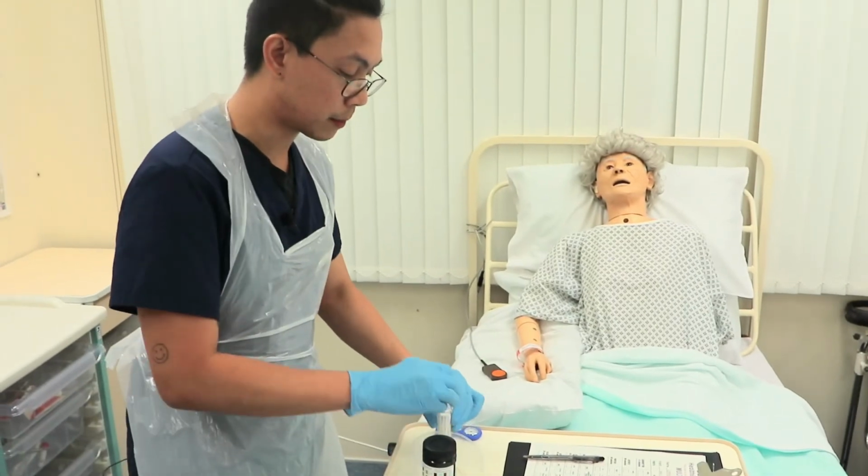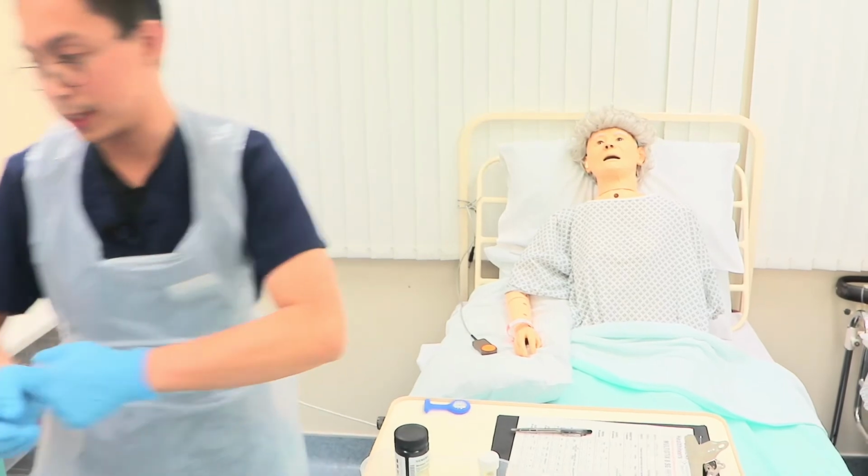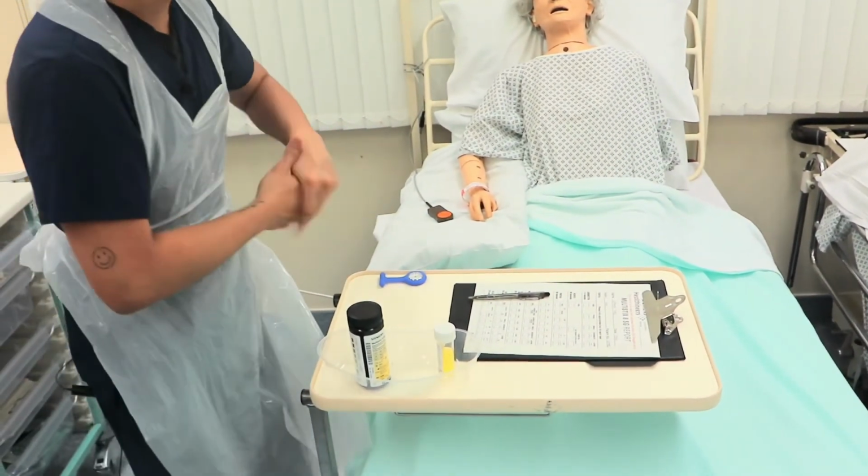Quickly close this specimen bottle and make sure to take off my gloves one at a time and dispose of them to the clinical waste bin. Do a quick hand rub and start documenting my results.